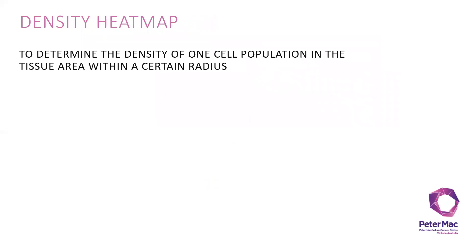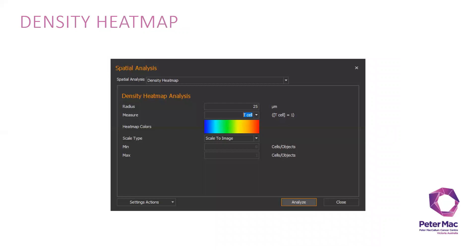The last one is density heat map analysis, which allows you to determine the density of one cell population in the tissue area within a certain radius. Here I set the radius of 25 microns to measure the T cell density.